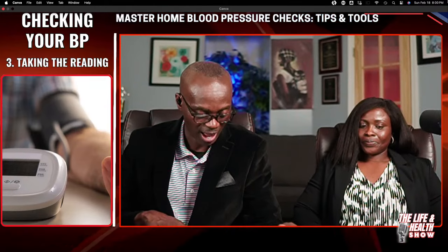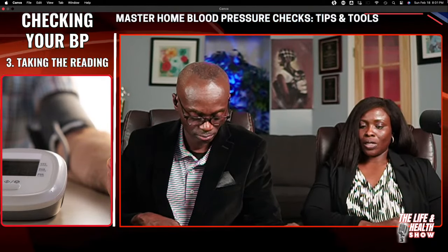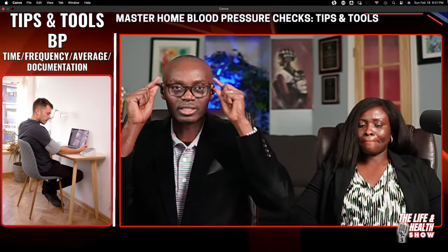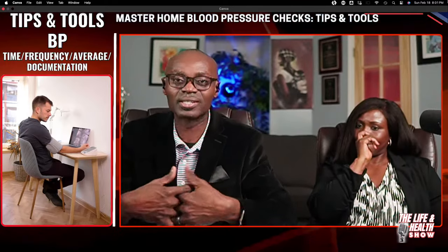So I think those are the things that we wrote down. And then you can take two or three readings, 1 minute apart. Yes. So now with that, I think she already started on the tips. So now what are some of the tips? We showed you the process of taking the blood pressure, but the tips to getting the numbers really good is what she started with. She's saying that take multiple checks, read multiple times, and then strike an average, right?